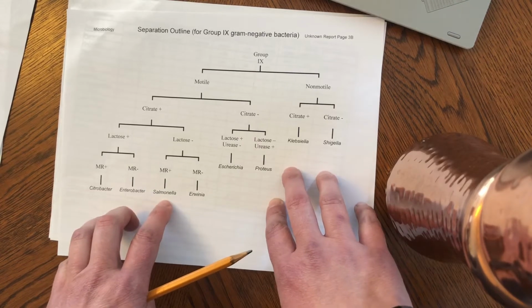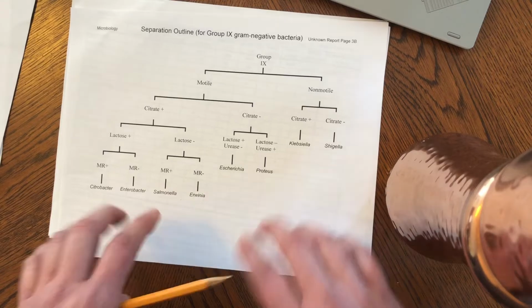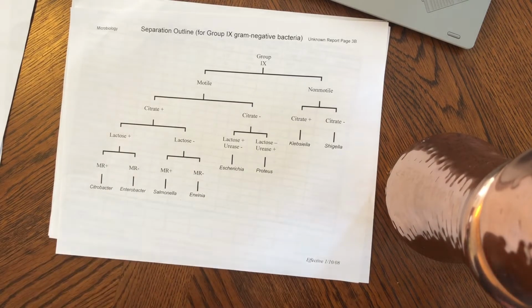If you didn't, you might have to email me and I'll have to try to help you figure out what went wrong. Sometimes things go wrong because test results aren't always what they should be. When you get a positive test result, that means that 90% or more of that same species is going to give you the same test result. But that means there's 10% that you could get a negative. Like if you were expecting a positive, you could maybe get a false negative sometimes.